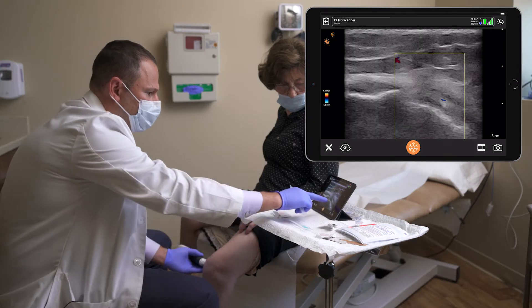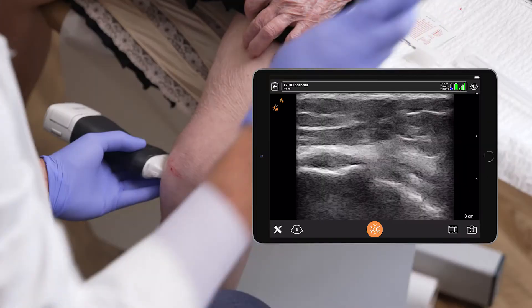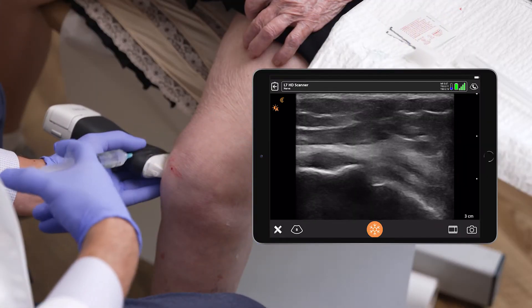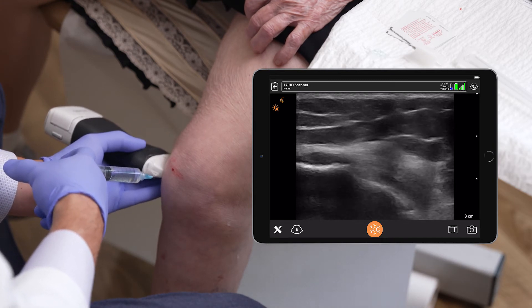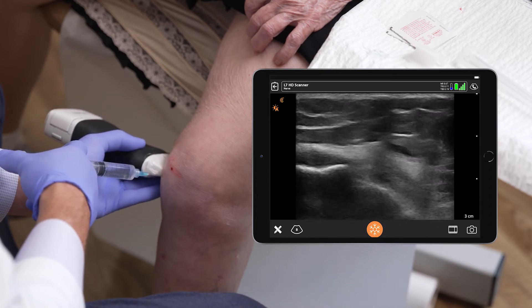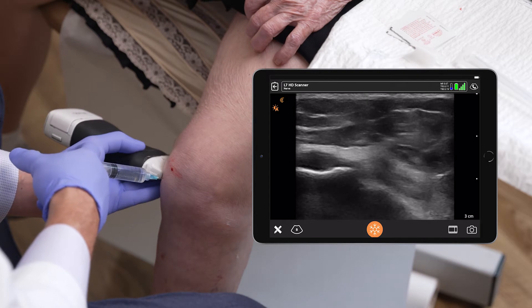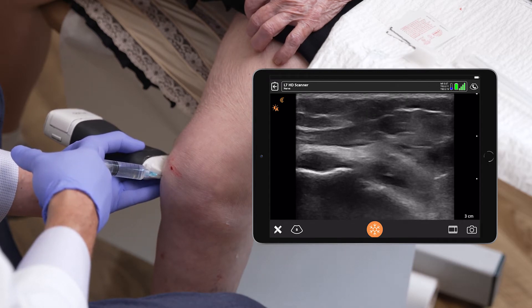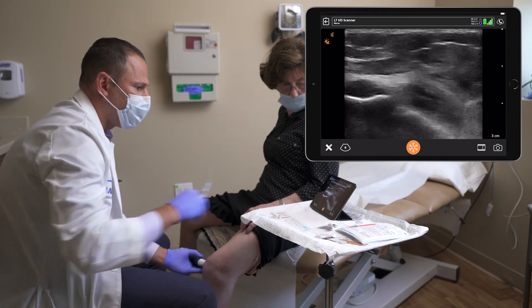It appears that the nerve is right here. Take off my Doppler. A little pinch. I'm injecting another one to two mLs around the genicular nerve in the inferior medial position. The bone over here is the tibia.